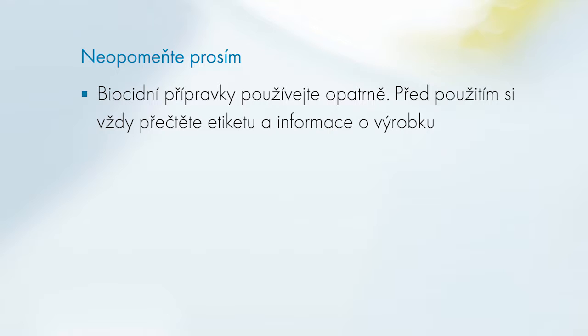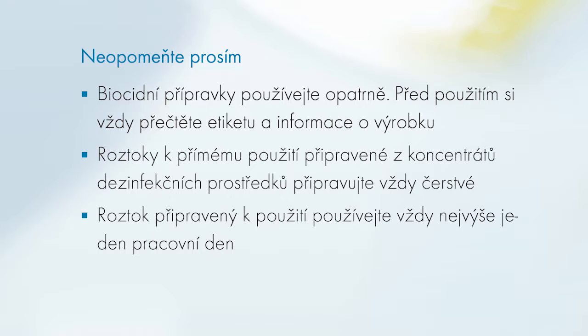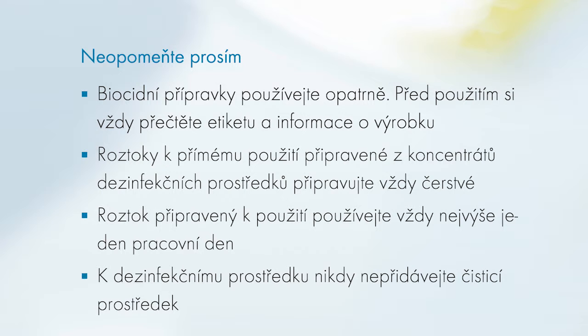Please note: use biocides with caution. Always read the label and product information before use. Ready-to-use solutions from disinfection concentrates must always be freshly made. A ready-to-use solution cannot be used longer than 1 day. Never add a cleaning agent to a disinfection solution.